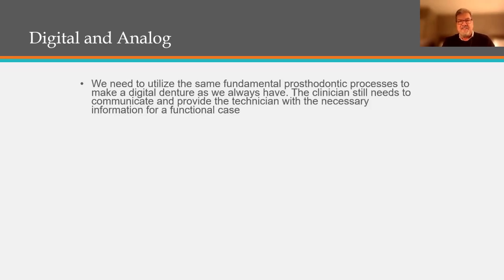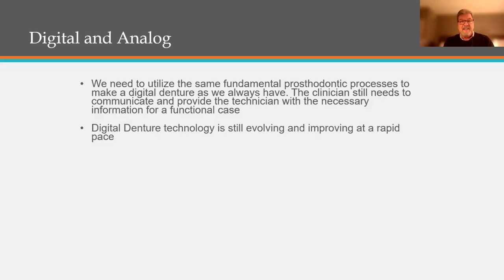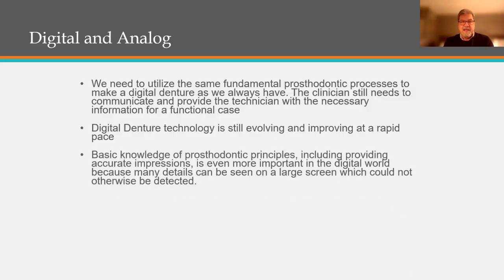We still need to utilize the same fundamental prosthodontic processes to make a digital denture as we always have. The clinician still needs to communicate and provide the technician with the necessary information for a functional case. Digital denture technology is still evolving and improving at a rapid pace, but the basic knowledge of prosthodontic principles, including providing accurate impressions, is even more important in a digital world because many details can now be seen on a large screen, which we couldn't detect otherwise previously.